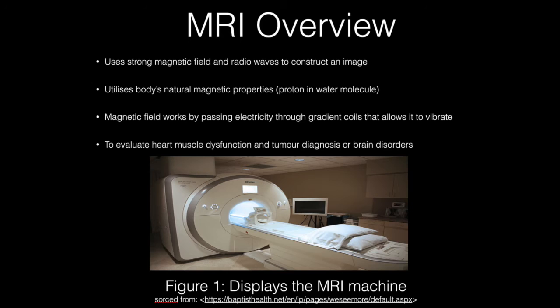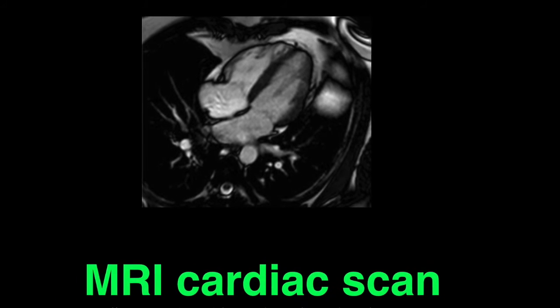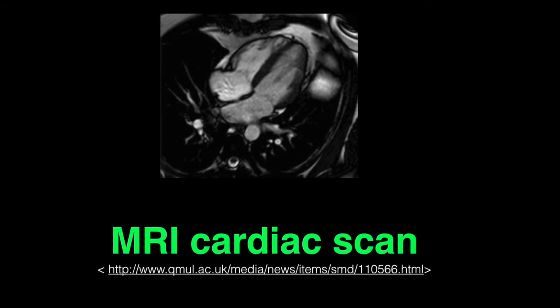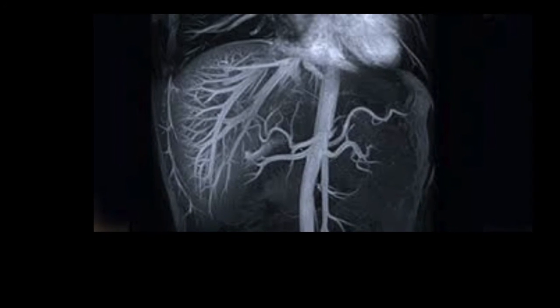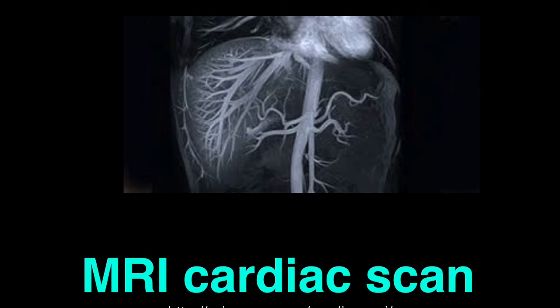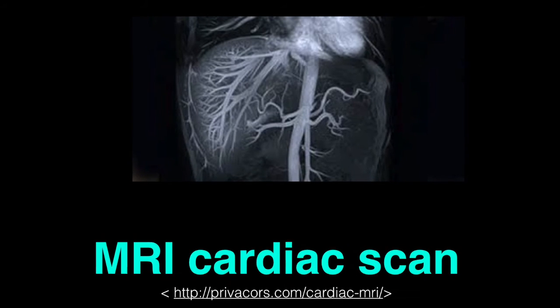This magnetic field is triggered by passing an electrical wave through a gradient coil that vibrates, resulting in a knocking sound inside the scanner. The main purpose of this imaging technique is to evaluate heart muscle dysfunction and to diagnose tumors or brain disorders. Altogether, magnetic resonance angiography is observed to have a huge impact in today's society, as it allows radiologists to assess the health of blood and lymphatic vessels in our body using the images constructed by this imaging modality on the computer. Thus, this modality helps in the early diagnosis of serious life-threatening diseases such as atherosclerosis.